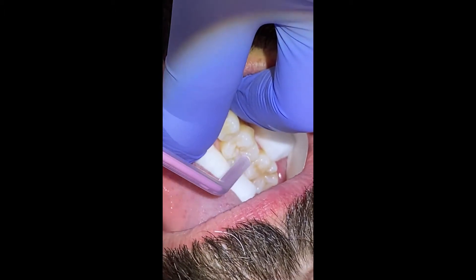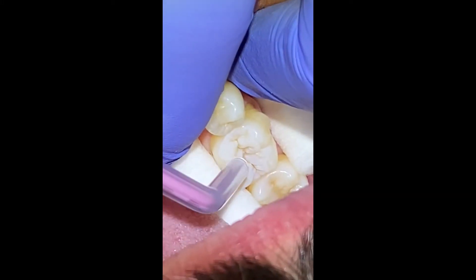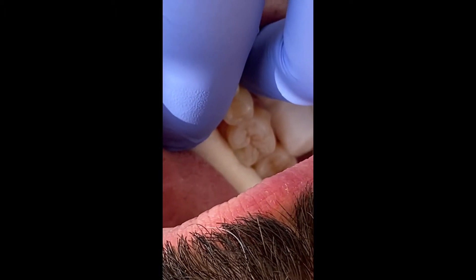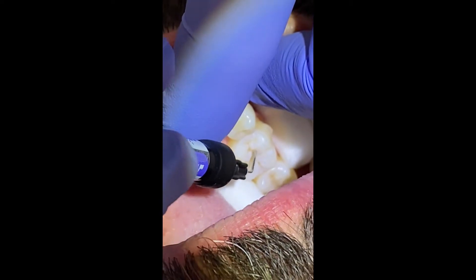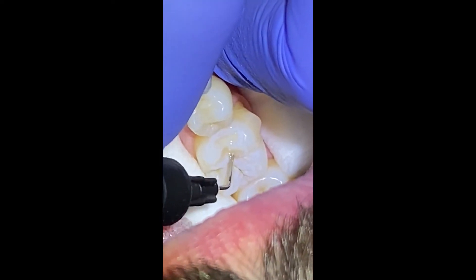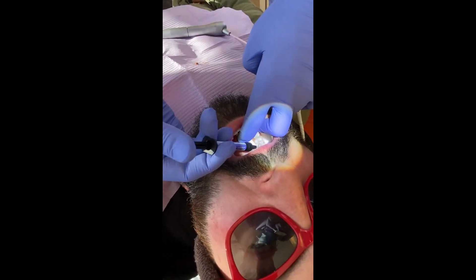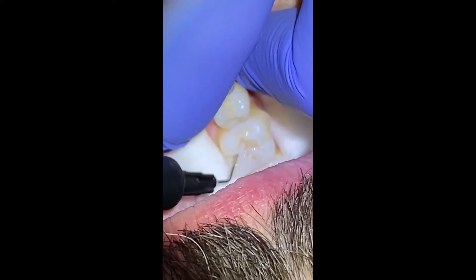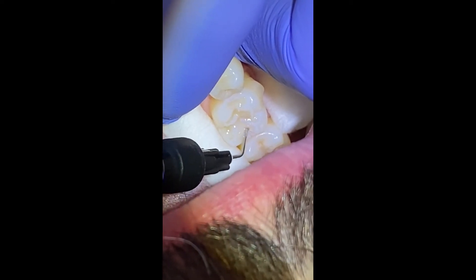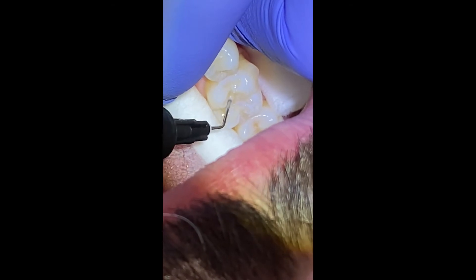We're going to go ahead and dry this tooth off. When you dry off a tooth that's been properly etched, it is going to have that chalky white appearance. Once you have that chalky appearance, you're going to grab your sealant. You take a little bit and milk it onto the patient's bib or onto your tray, and you start to apply the sealant into the pits and grooves of your teeth. This sealant is actually coming out all on its own — I have my thumb on the syringe but I'm not even using pressure because it's just flowing right out. We're going to make sure we get this into all of the pits and grooves of the teeth the best that we can.